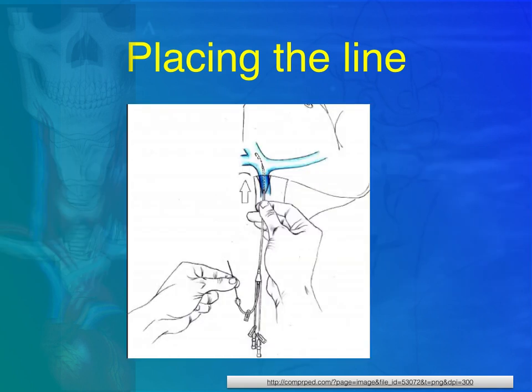After dilating the skin and withdrawing the dilator, you can pass the distal part of the catheter through the wire. Always have control of the wire and never pass a catheter if one of your hands is not in control of the wire. So when you are passing the catheter at the beginning, you should have control of the wire, and once the wire appears in the distal portion of the catheter, you should again grab it.